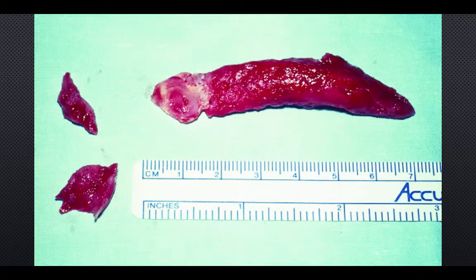One of the most feared complications is thrombosis of the pump. This will manifest as increased power consumption from the pump, known as power spikes. There will also be a low output state from the pump and increased pump speeds required to maintain adequate flow. A smear of the patient's blood might also show hemolyzed red cells. Diagnosis is made with an echocardiogram, but a cardiac CTA can also be used. Treatment is with heparin and antiplatelet medications. TPA can be used in life-threatening situations.